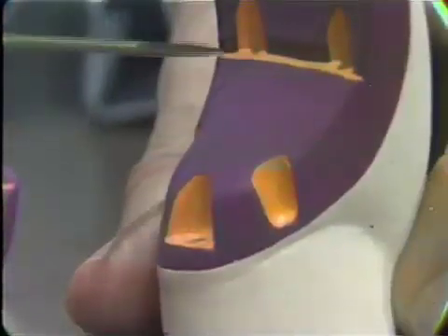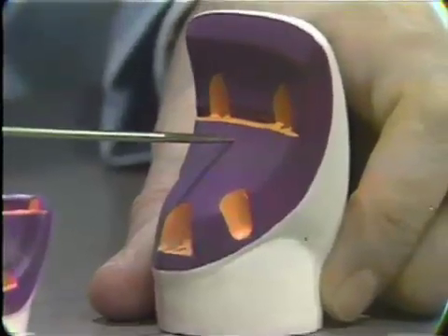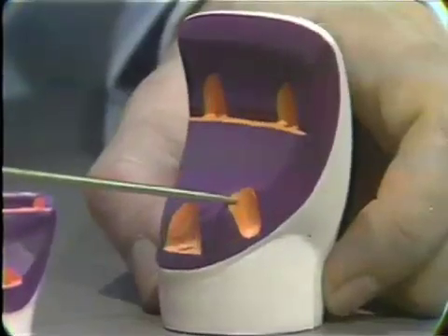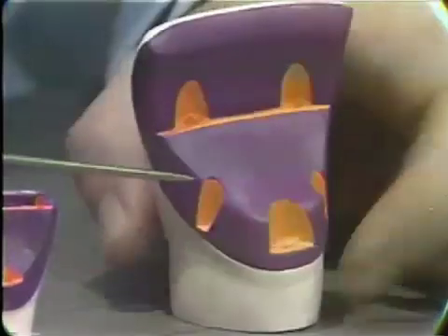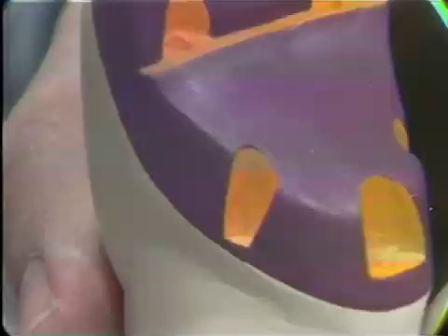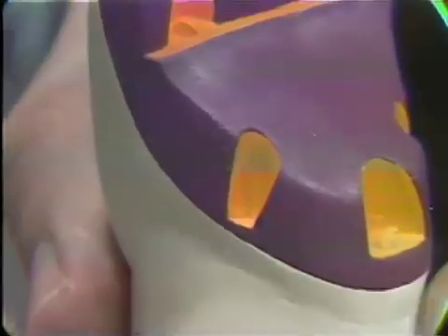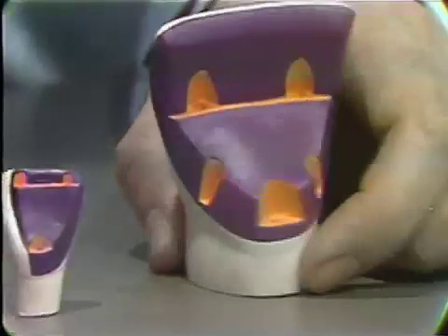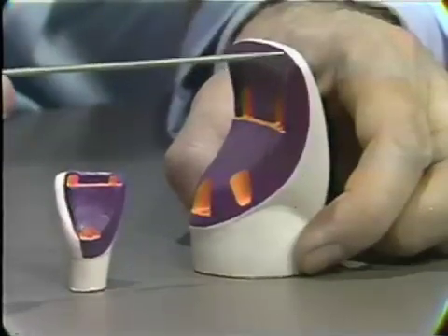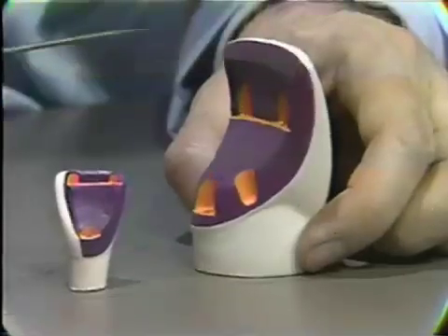These have to be placed as far proximally as possible in order to avoid the central pulp tissue here, and additional retention can again be obtained if necessary by cutting little grooves or lugs into the axial surfaces of the lingual part of the tooth, as was done for the three-quarter crown preparation. Again, the extent of this incisal edge here can be varied according to the amount of protection which is required.